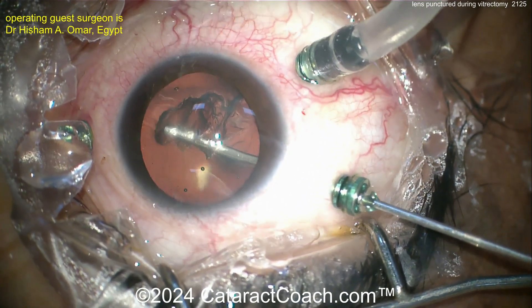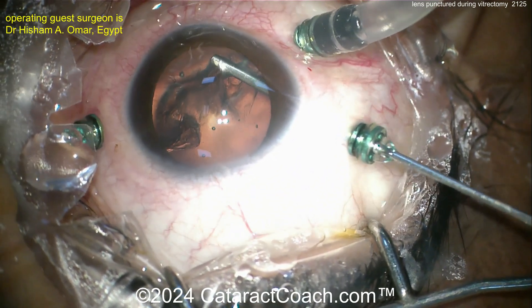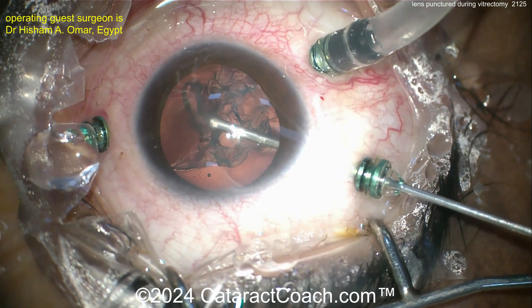Not a very dense lens, so the patient is probably on the younger side — looks like some dark eyelashes too, so probably a younger patient. Removing the entire crystalline lens here.